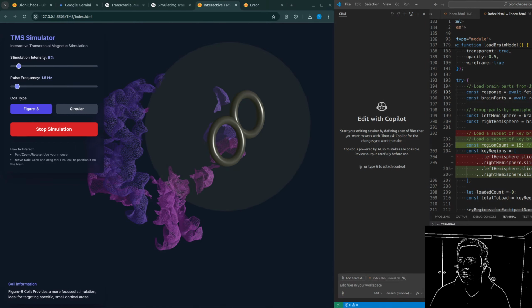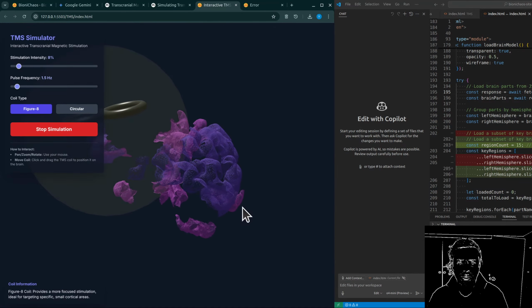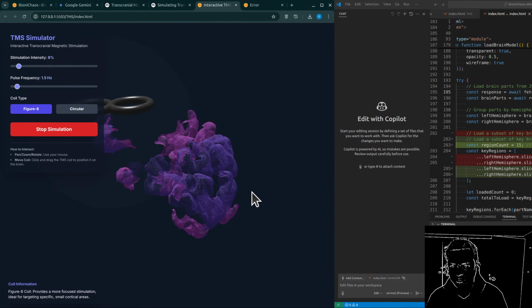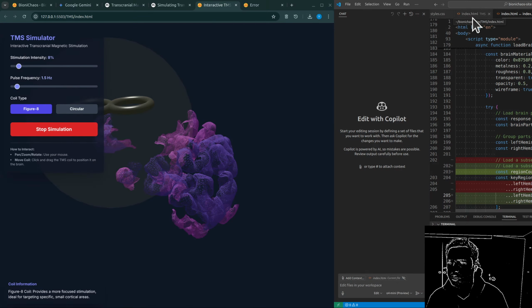Okay, so we've gone from the digital anatomy to the physics of the coil and E field, now into simulating how individual neurons and potentially whole networks might respond. Is there a final stage? Does it try to connect all this simulation work back to something we can actually see or measure in a person? Yes, absolutely. That's stage 4, and the source material describes it as the final frontier, essentially, predicting physiological and cognitive outcomes. The final frontier. Okay. This is all about bridging those simulated changes in neural activity, the firing patterns, the network dynamics, to observable results. Like what, for example?